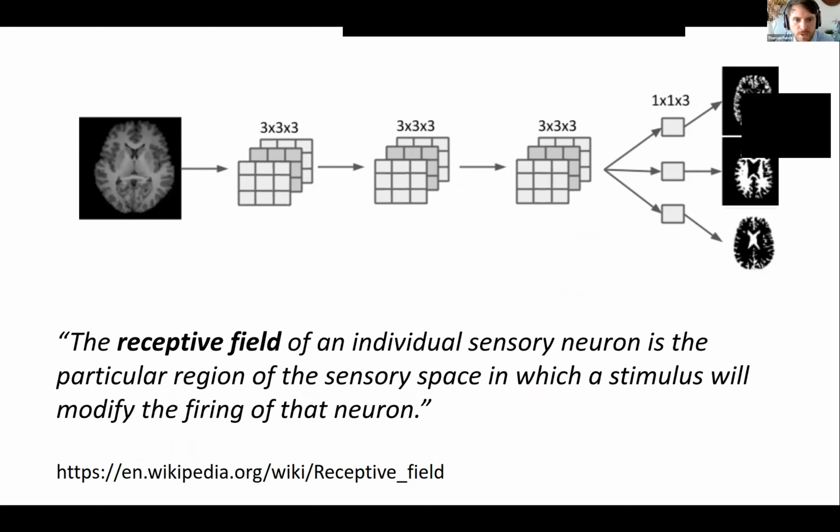An important reason why these work well is that the convolutional neural network can learn features from the image, but it can also learn high-level features. The reason is that at each subsequent stage in a convolutional neural network, so here you have one stage, and here would be another stage and another stage, the kernels see a bigger and bigger portion of the image, and so can extract larger and larger and more high-level features. The idea behind this is the same as for neurons.